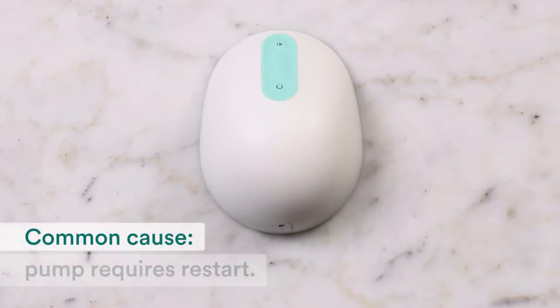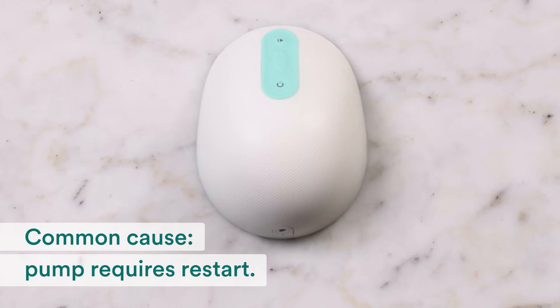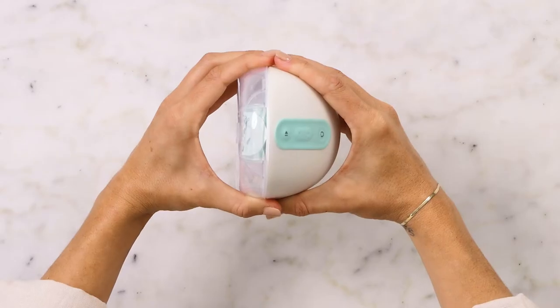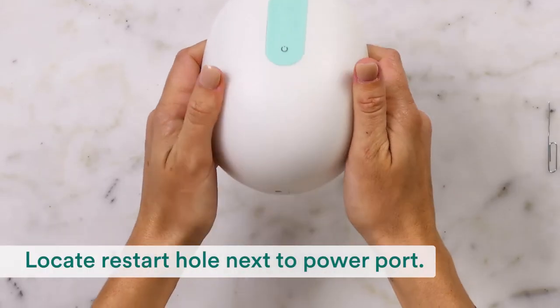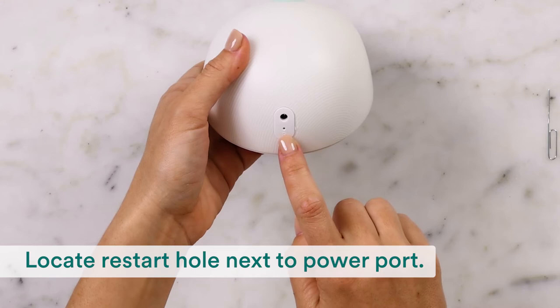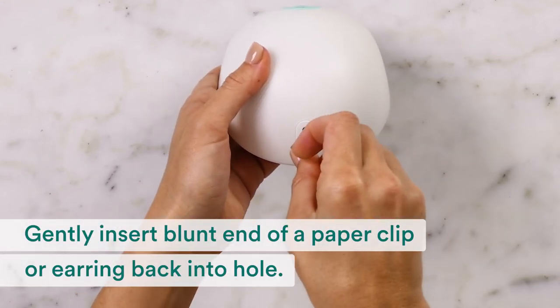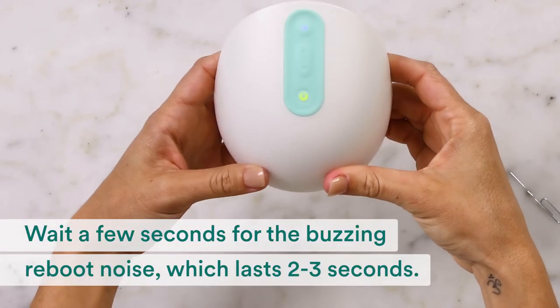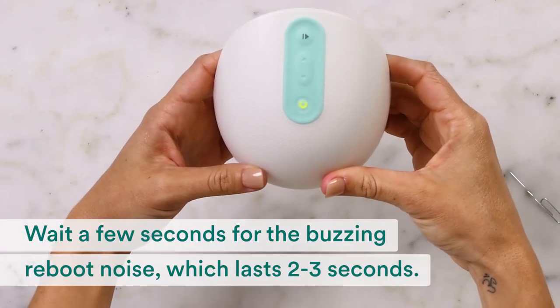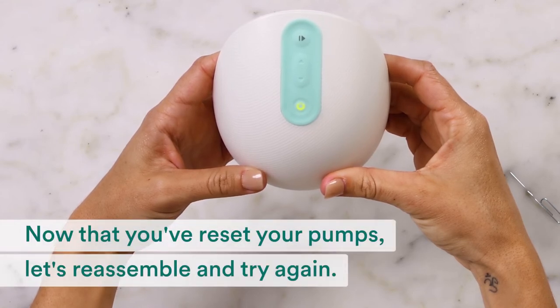If you still see an orange blinking light, let's try something else. Like any electronic device, sometimes your pump just needs a restart. First, separate the pump from the flange. Locate the small restart hole next to the power port. Gently insert the blunt end of a paper clip or earring back into the hole until you feel a slight resistance. Pull it out and wait a few seconds for the buzzing reboot noise. Now that you've reset your pump, let's reassemble and try again.